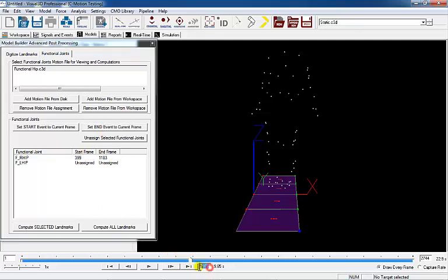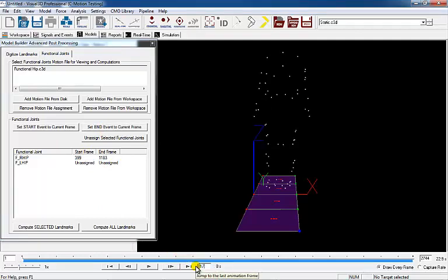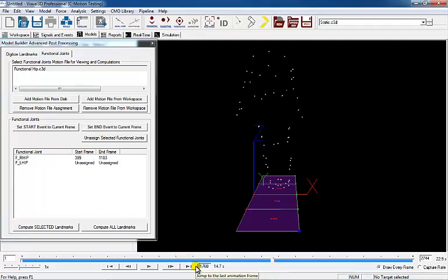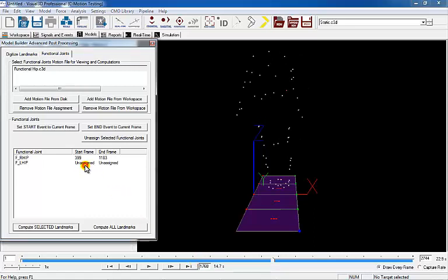Select the beginning of the left functional hip motion by going to frame 1160, selecting FL hip, and click Set Start Event to Current Frame.